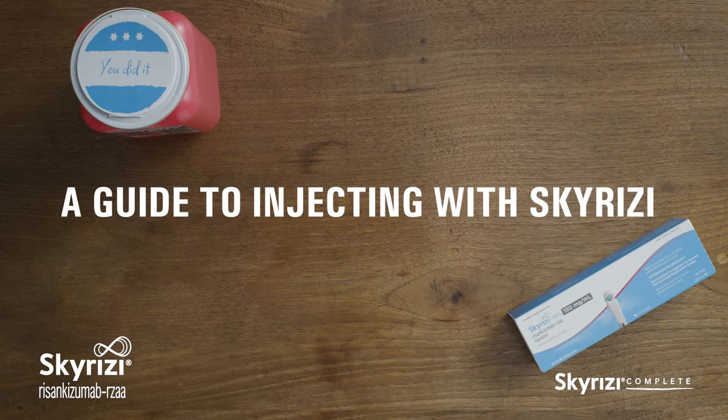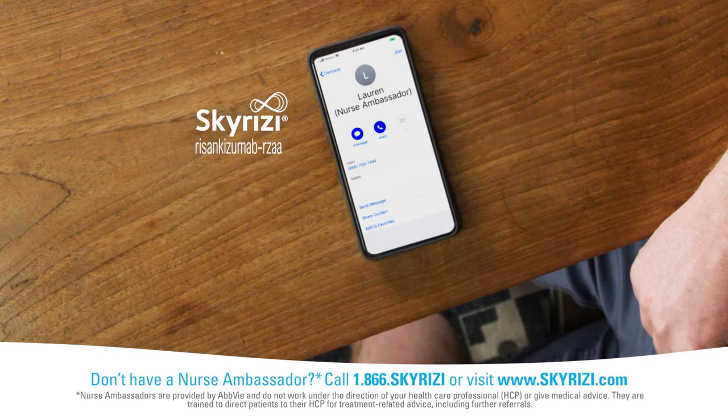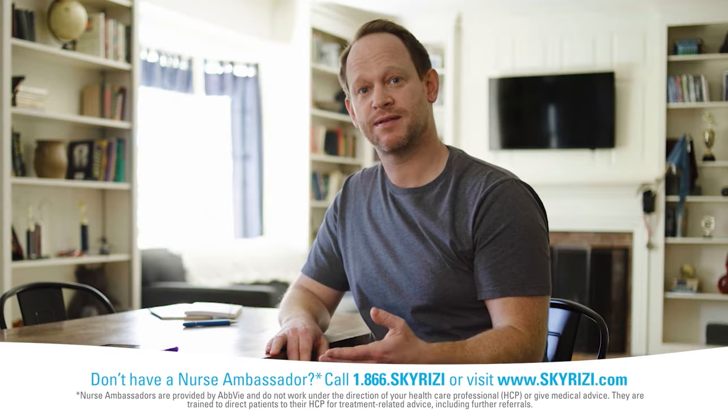Hi, I'm Michael, and I'm here to show you how to inject using a Skyrizi pen. I've been doing this for a while now, and I feel like I have a good handle on it. My doctor showed me how to inject when I first started, and I called Lauren, my nurse ambassador, and she helped me the first few times I did it at home by myself.